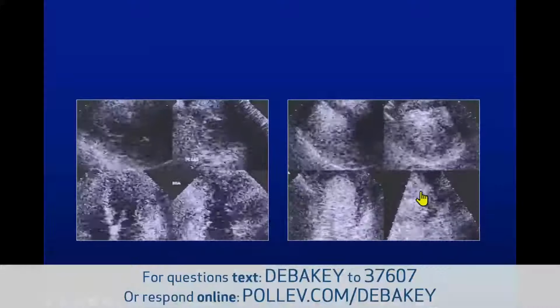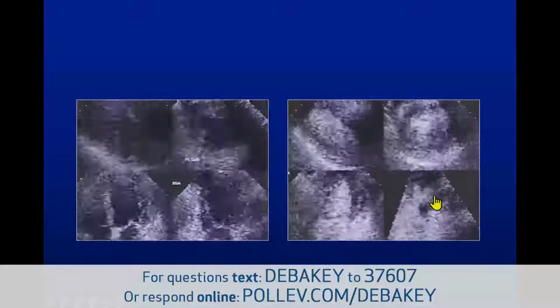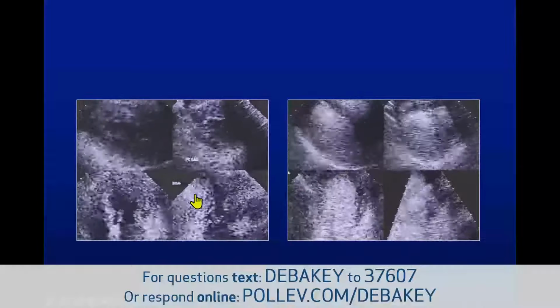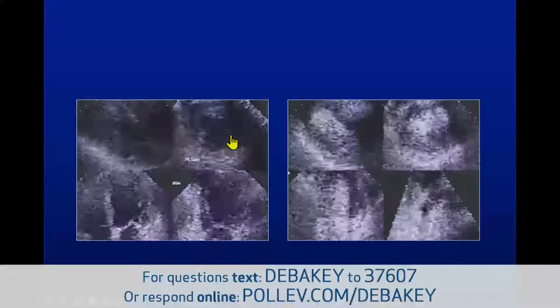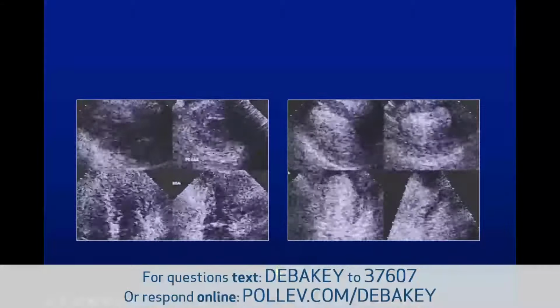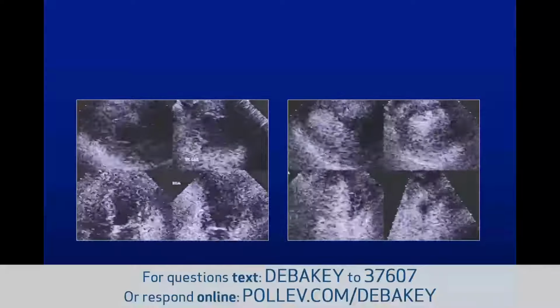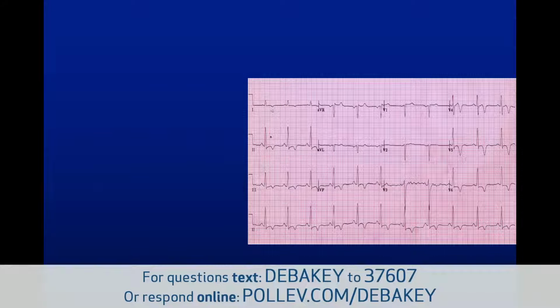there are some very unusual situations where you have an aneurysm in the middle of the anterolateral wall as opposed to distally. And this was completely missed by myself. Why? Because I connected these dots here, and this is actually where the dropout was felt to be still normal. And therefore, this is the power of such a tool, to be able to see much better, so therefore you can evaluate regional function in addition to global function.